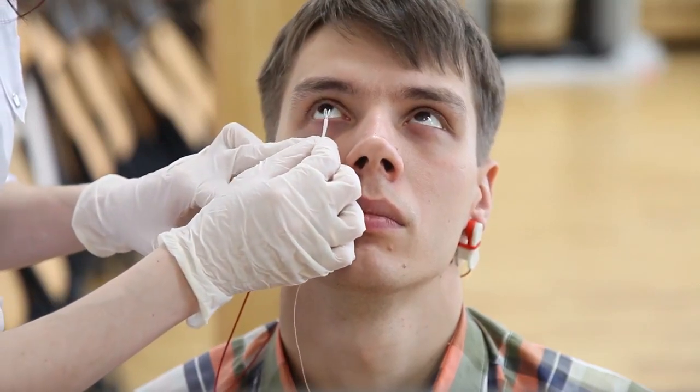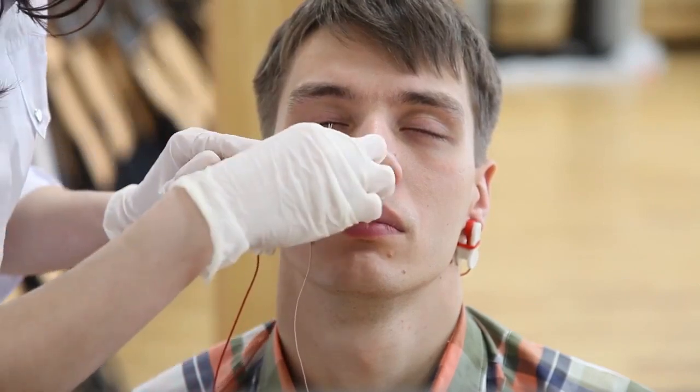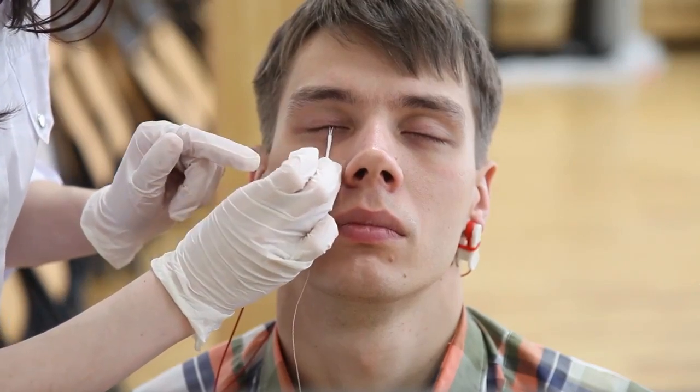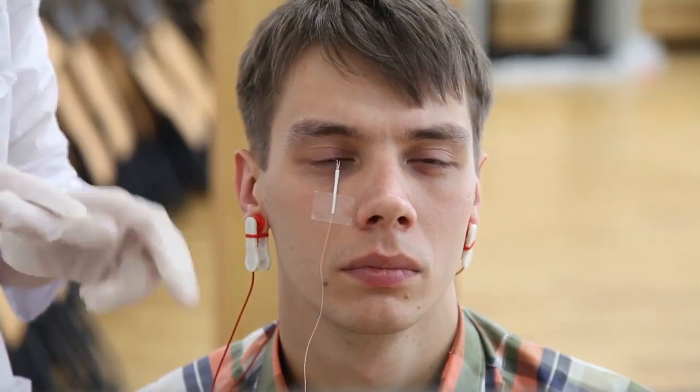Then we should fix the corneal hook-shaped electrode. To do it, ask a patient to look upward, pull off the lower eyelid and position the hook. After that, release the eyelid and fix the electrode cable with the medical tape. The electrode cable is plugged in the device via the special adapter.